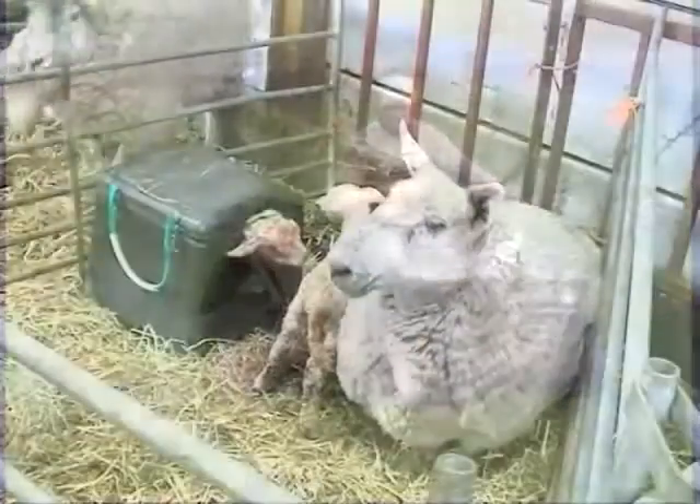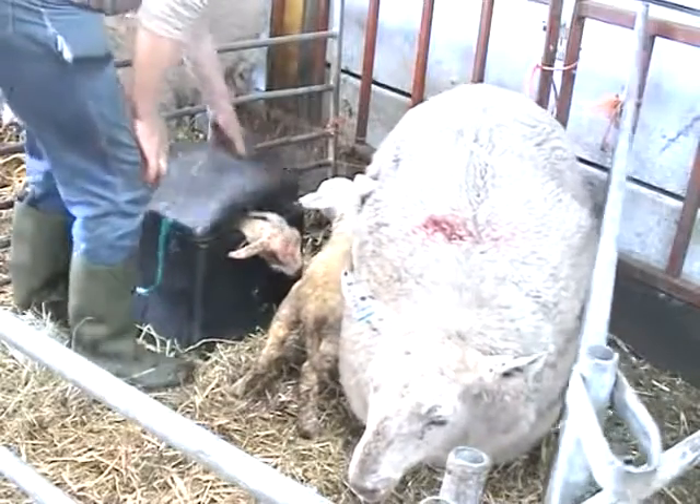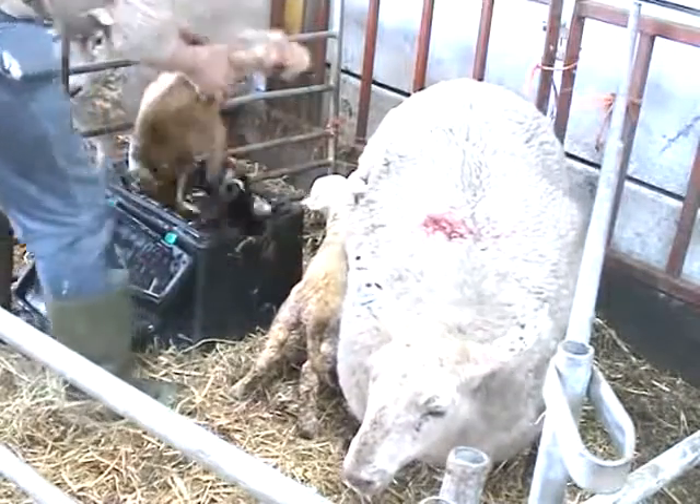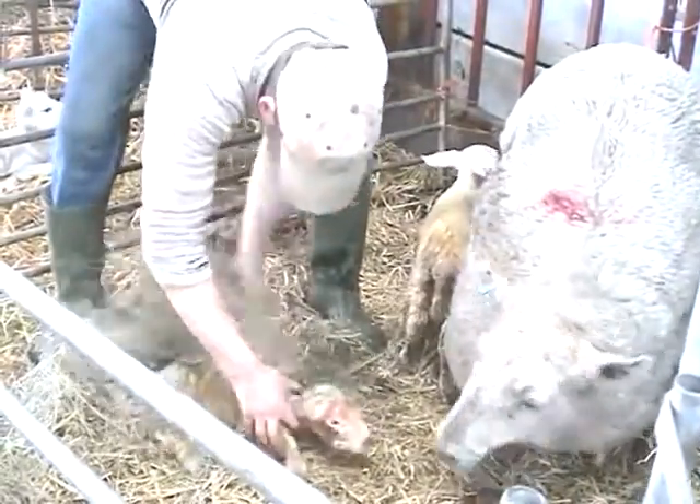After about 30 minutes, the lamb will have regained its strength and can feel its feet on the base of the Woolly Warmer and can practise standing. Quickly dry the excess water off the lamb and return it to the ewe.